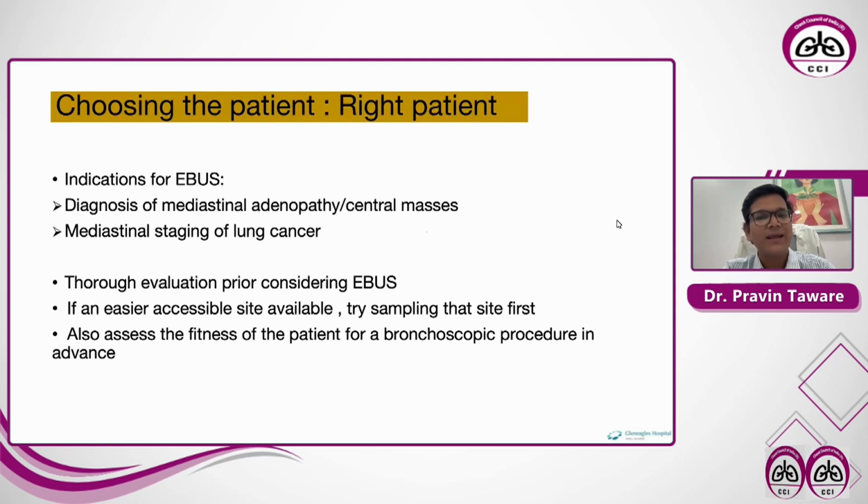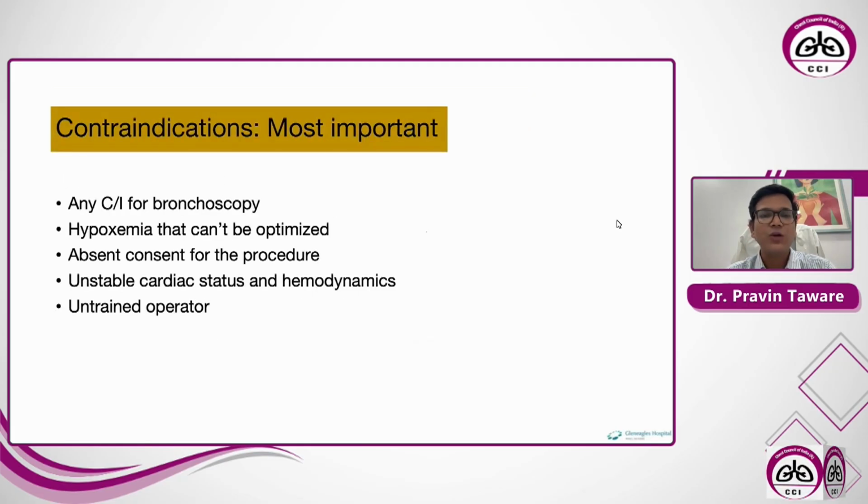Thorough evaluation prior to considering EBUS is very important, and if an easier accessible site is available, try sampling that site first, and also assess the fitness of the patient for the bronchoscopic procedure in advance. You should know when not to do the procedure, so you should know the contraindications, which is very important. Any contraindication for bronchoscopy, you should avoid EBUS.